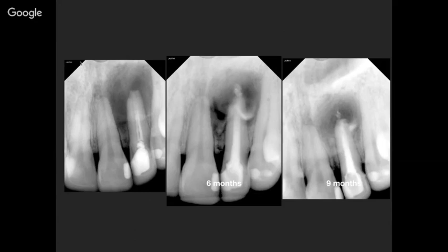From a surgical procedure, we stepped into a conventional, conservative one, with no blades, just doing the root canal from the inside, a conventional non-surgical root canal therapy, and it ended with a smaller lesion. And we'll be following the situation with time. And I'm almost sure that it will be a complete healing. If not, a residual lesion will persist, but I'm sure that will be a very big advantage for the patient.